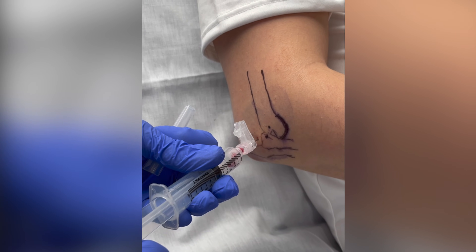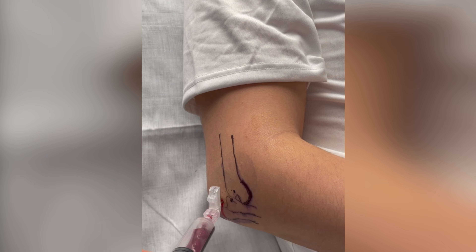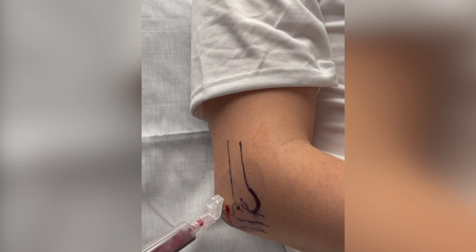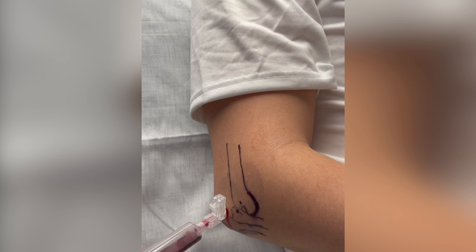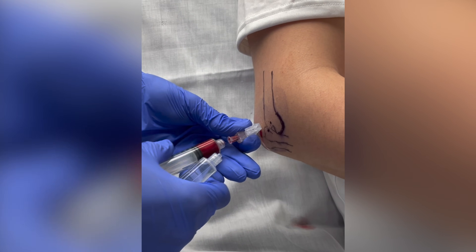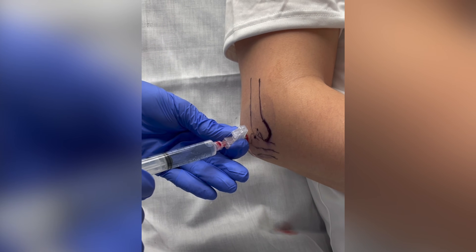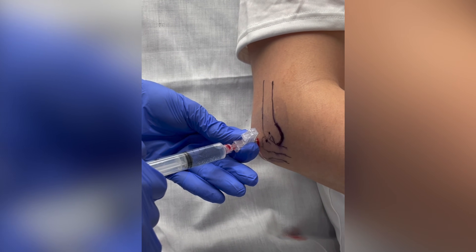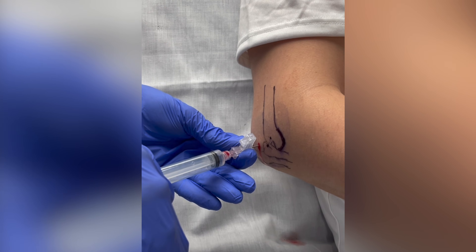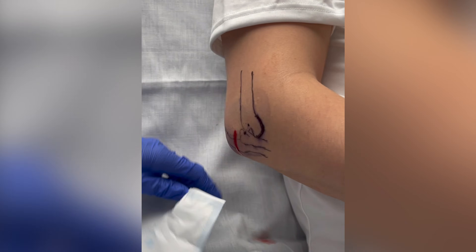Once in the joint, the hematoma should be aspirated, and it can be necessary to change the direction of the needle a few times to break up old hematoma. Once all the hematoma is aspirated, the 10cc syringe is detached from the 18-gauge needle, which should be left in the joint. The 10cc syringe with the lidocaine is then attached to the 18-gauge needle, and the lidocaine is injected into the elbow joint. There should be no resistance as the lidocaine is injected. Gauze can be used to tamponade the injection site.